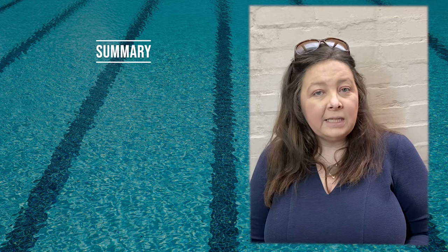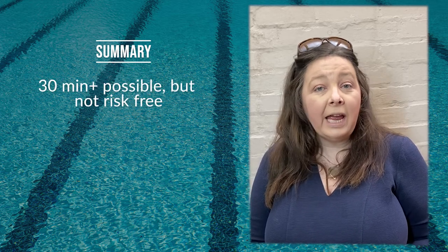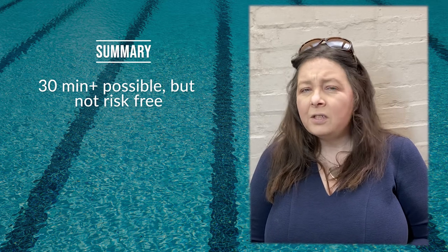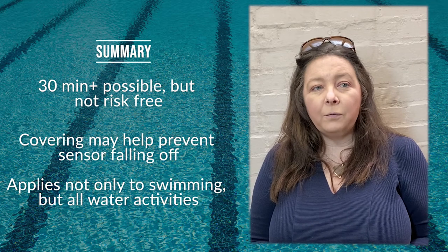To summarise, many sensor wearers do wear their sensor for longer than 30 minutes in water without any problems at all. There's not a way to waterproof your sensor, but covering it may help to reduce the chances of it falling off.